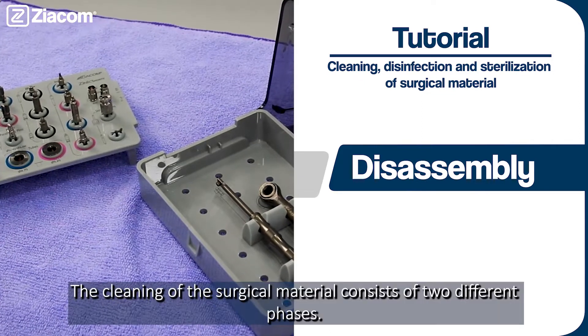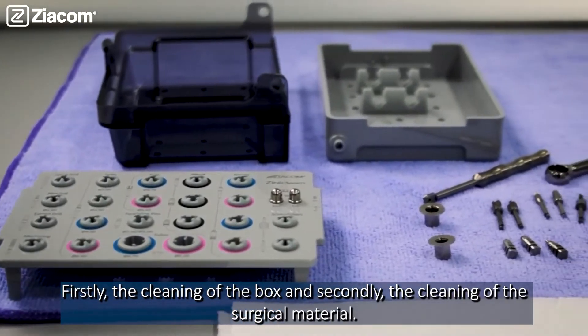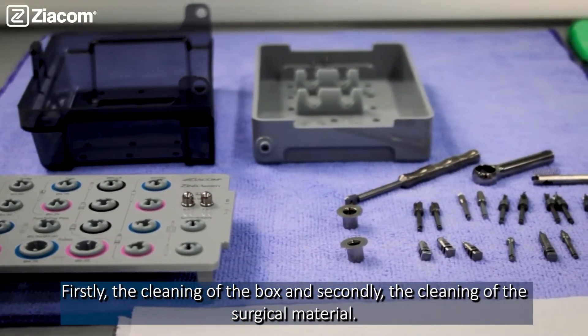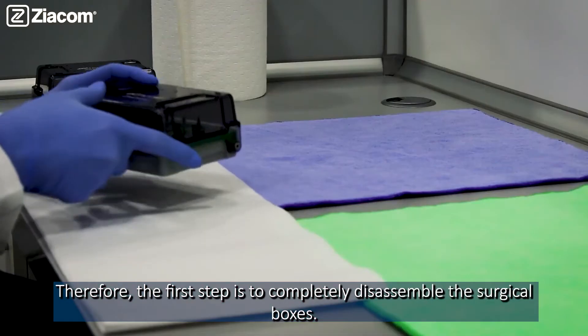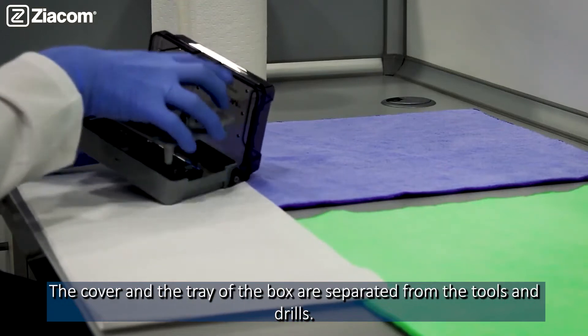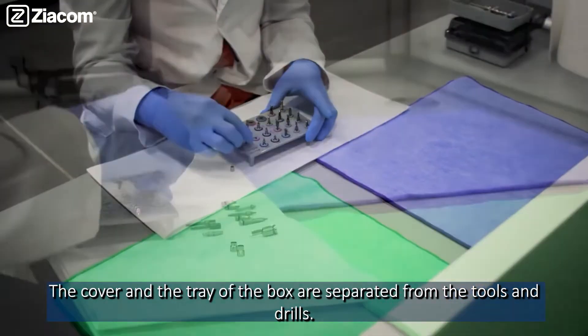The cleaning of the surgical materials consists of two different phases: firstly, the cleaning of the box, and secondly, the cleaning of the surgical material. Therefore, the first step is to completely disassemble the surgical boxes. The cover and the tray of the box are separated from the tools and drills.